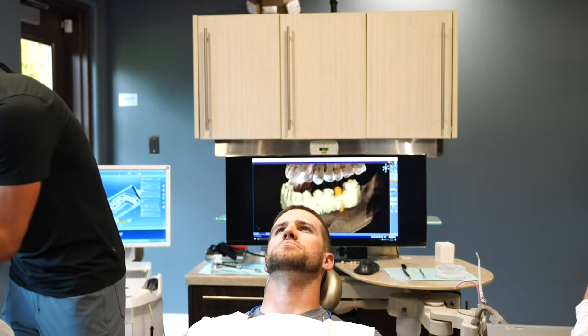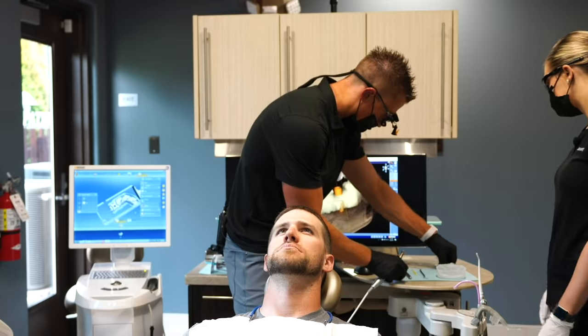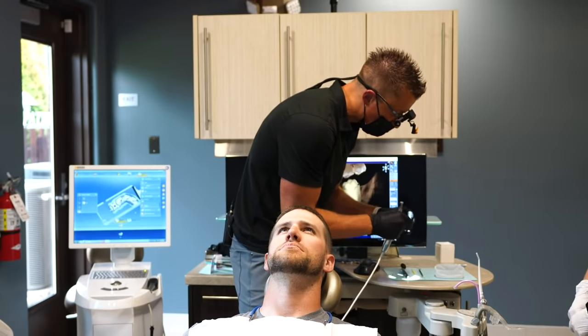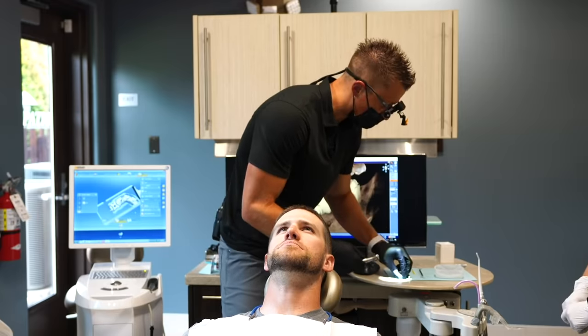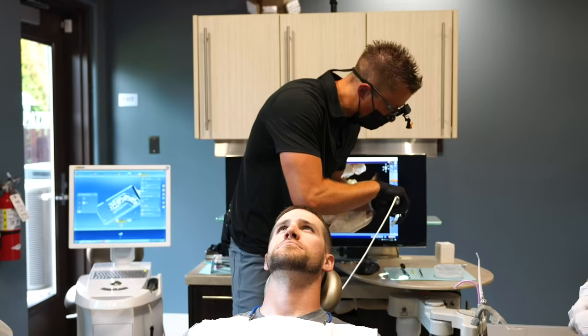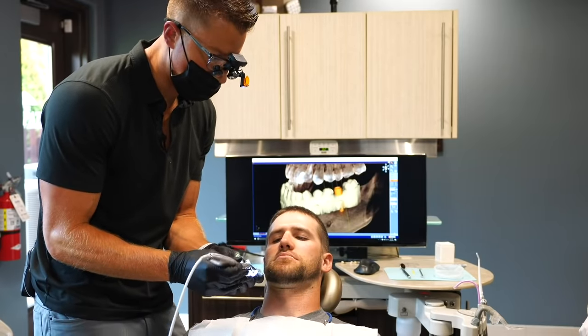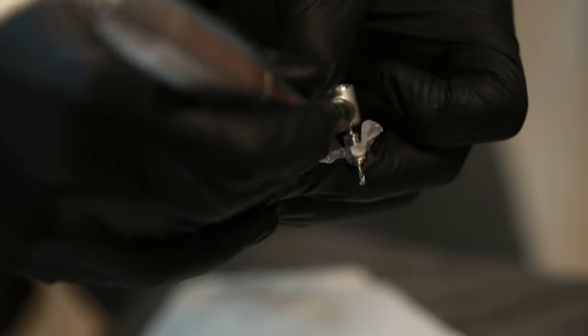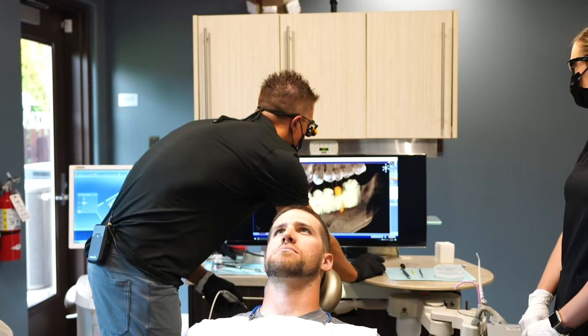So we'll use that. Let me show how these instruments fit within the guide. Okay. I'll bring it back over there so you can see it, Michael. This instrument, you can see, that's how they work. They slide into this guide, and it's controlled. I can't change access, even if I want to, because this guide is going to control that position. It also stops me when I've gone to the proper depth. So there's depth control, and there's angulation control. Both of those allow us to replicate that exact placement in his jaw. Here is another way of viewing that.